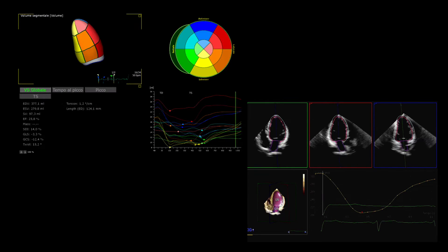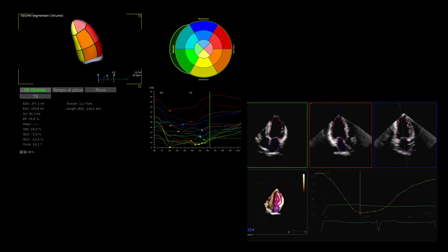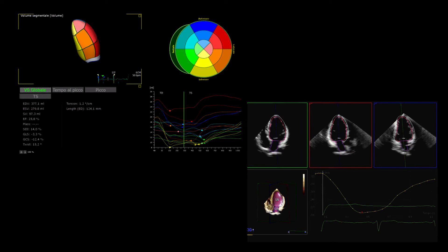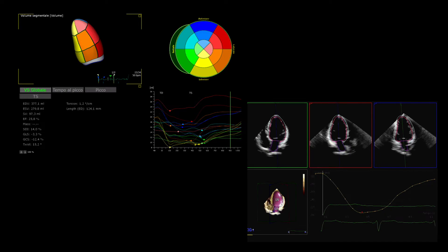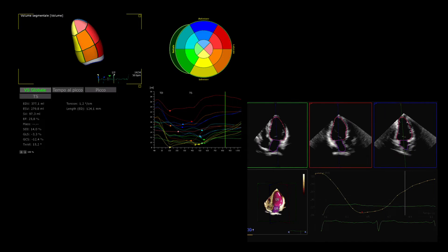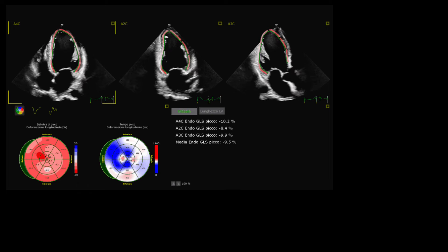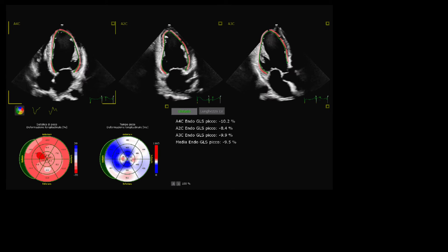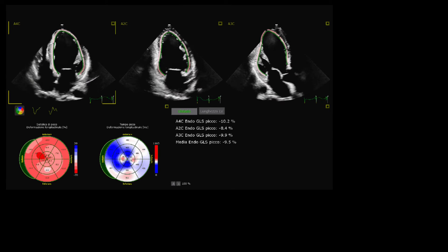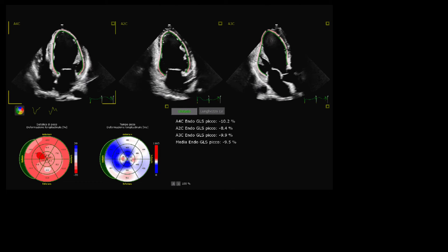Accordingly, it has been postulated that this technique may prove useful in the selection of patients for CRT. Speckle tracking echocardiography has emerged as a novel technology to detect myocardial abnormalities.